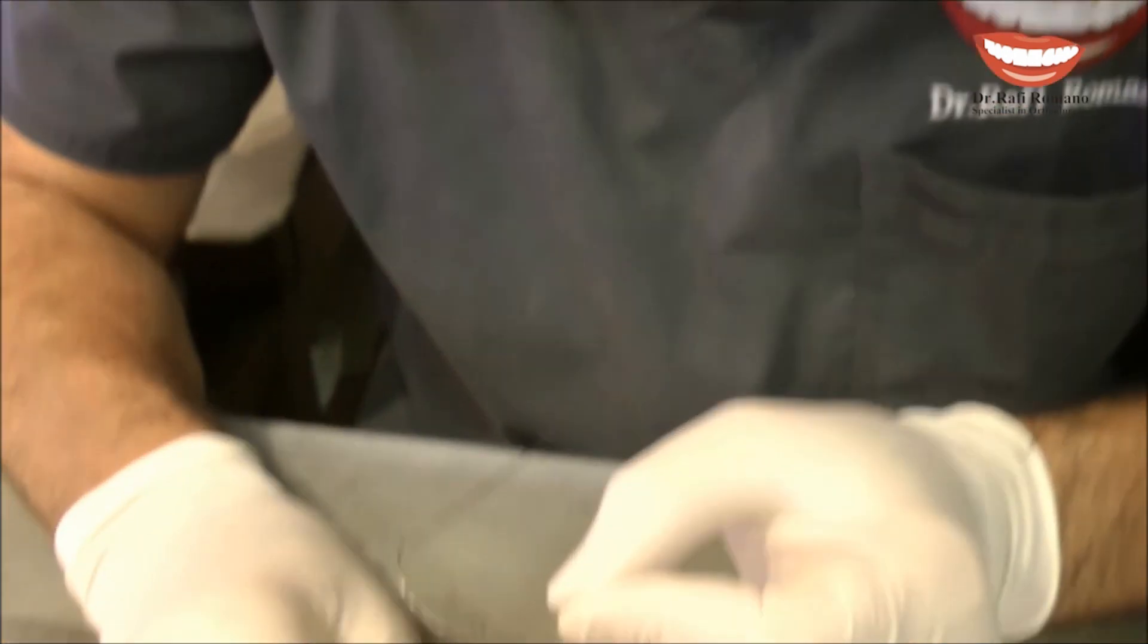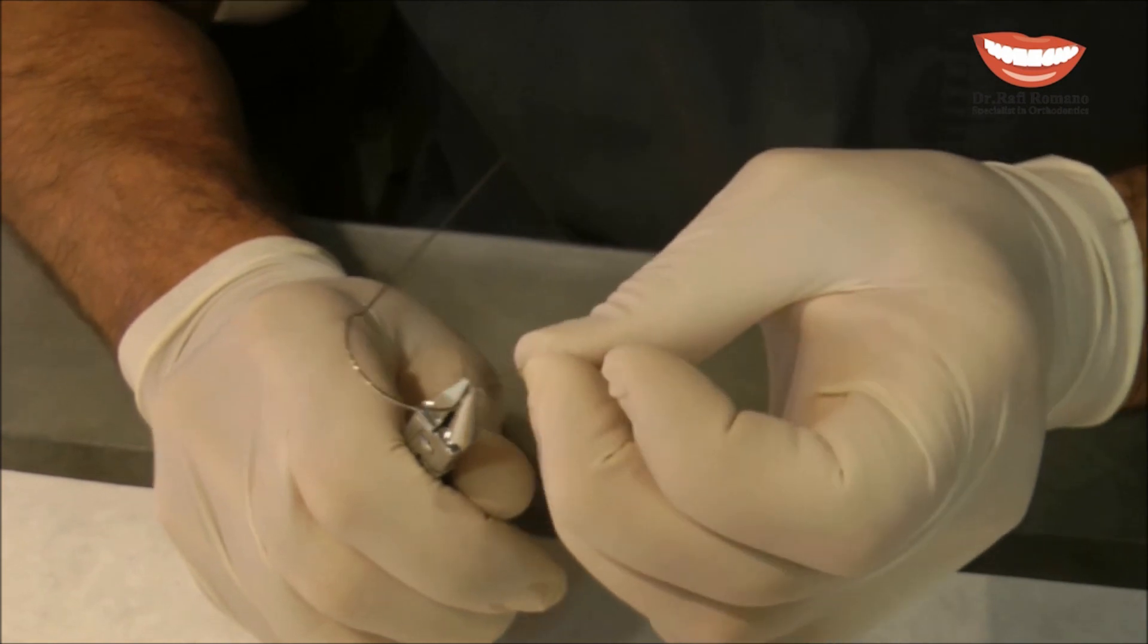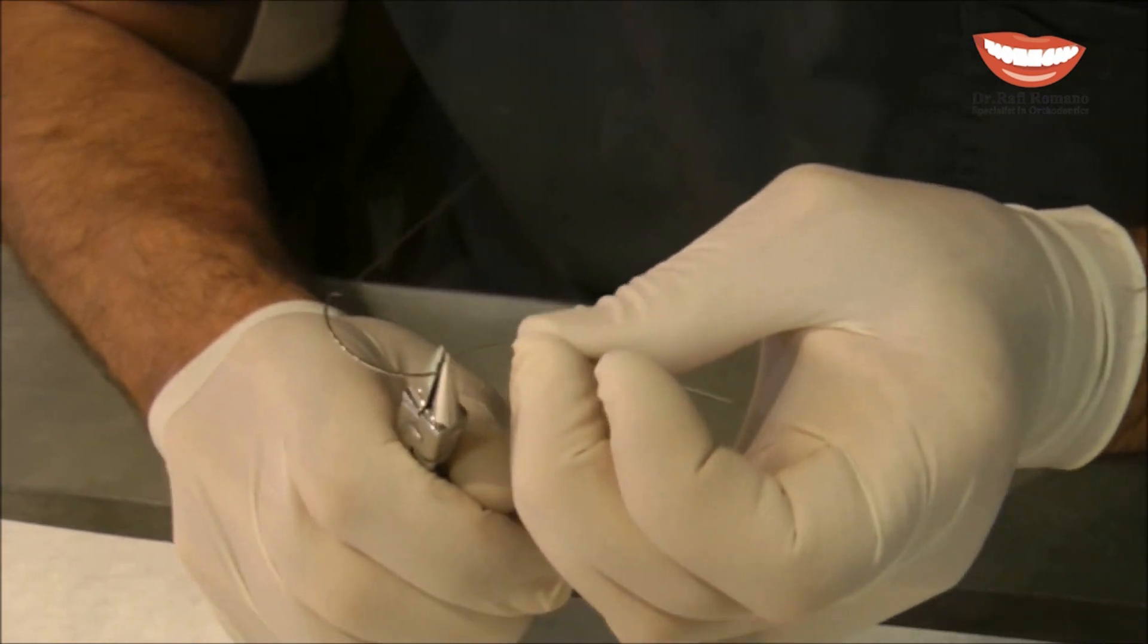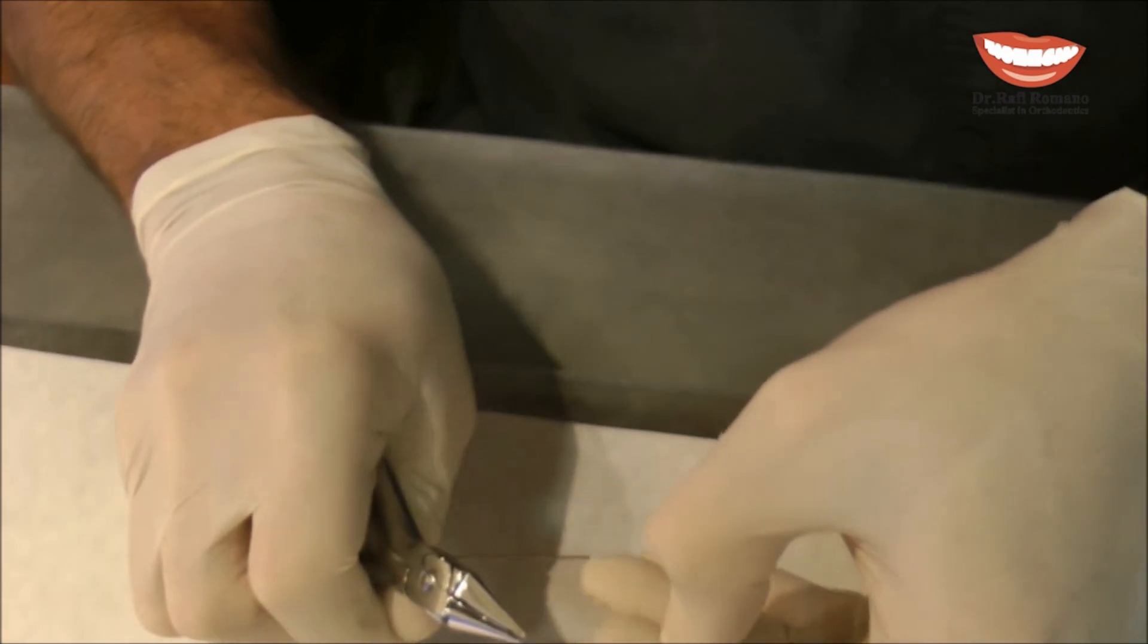So I take now and I enlarge the band a little bit in both dimensions, both horizontally and vertically.